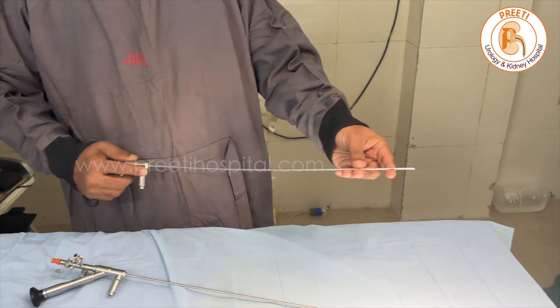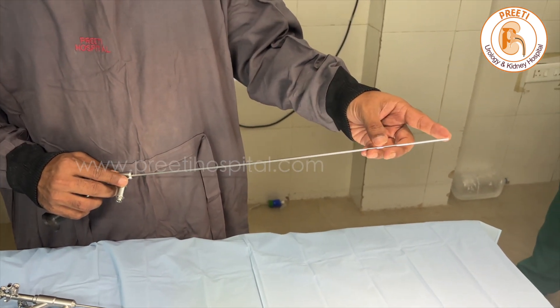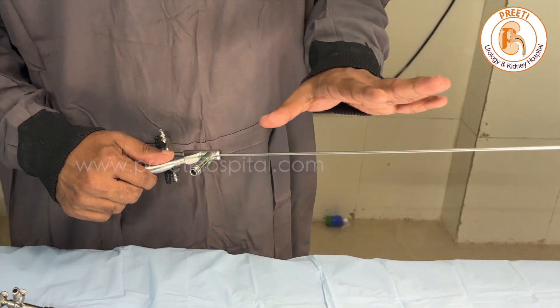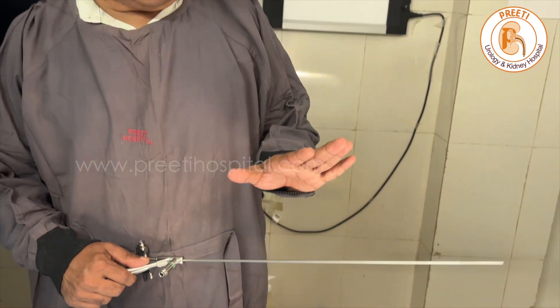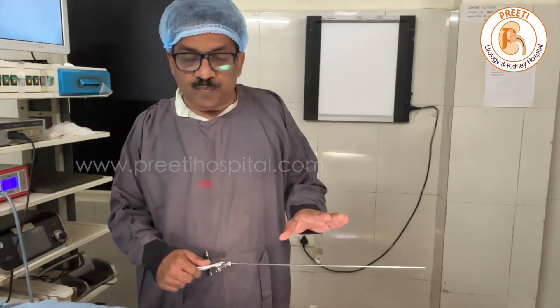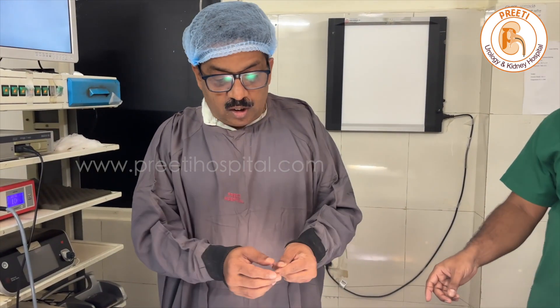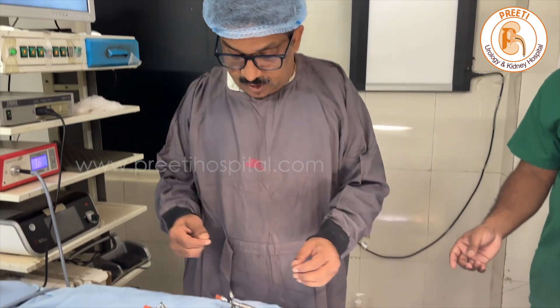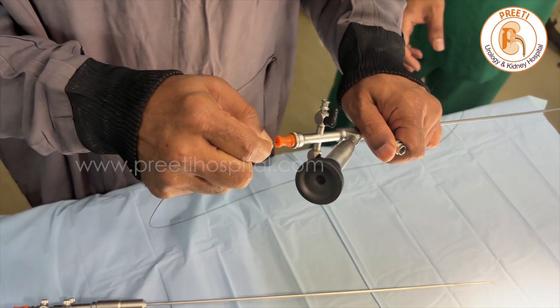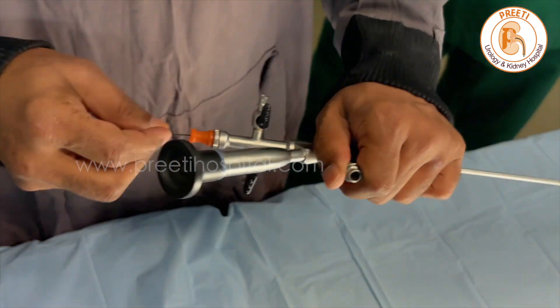We all require this needle scope very much. Its tip is 4 French and backside is 6.5. In this, no stent goes usually; maybe smaller stents may go — to my knowledge more than 3 French stent doesn't go. However, a 0.025 guide wire goes easily, and this is useful for any difficult ureteric access.